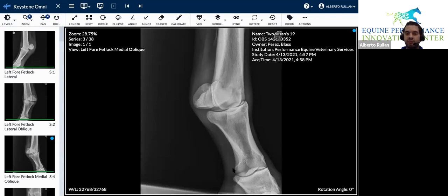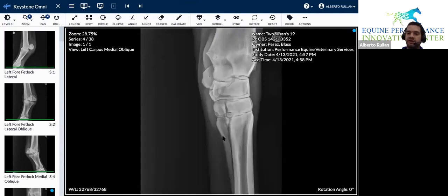And we go down P1 all the way to the pastern. Now, remember, distal to the pastern is the coffin joint. Sometimes you're gonna see some coffin joint areas, important to see. Now, here's the carpus. Back to the checklist.